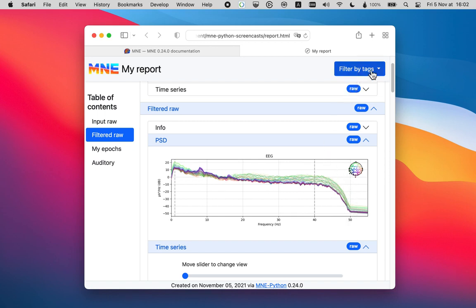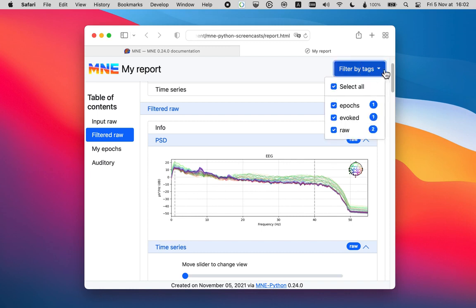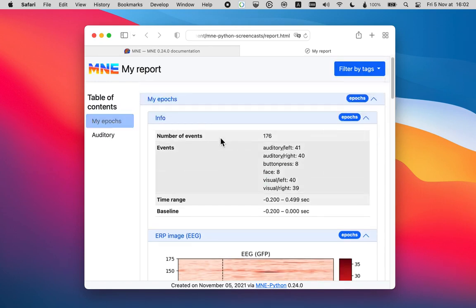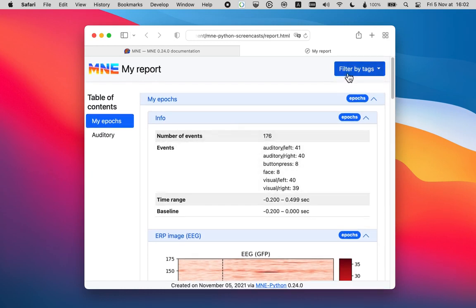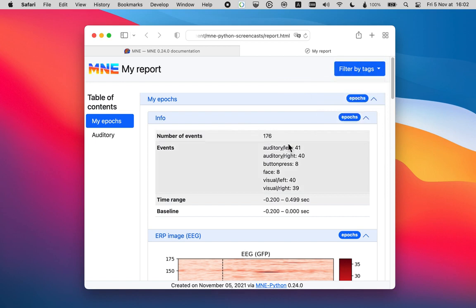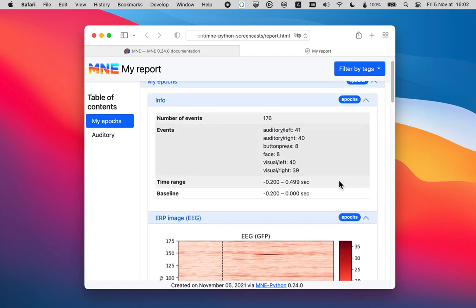We're done with raw. So let's just make use of these filter tags options we have here. So I'm just going to deselect raw and tada, the raw objects disappear from my report. They're not deleted. They're just not displayed right now. So now I can focus on the epochs.